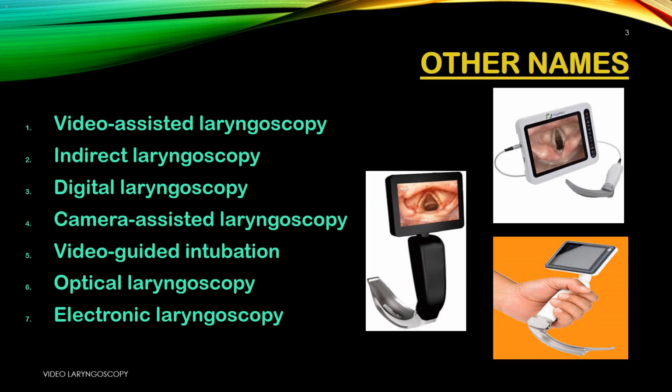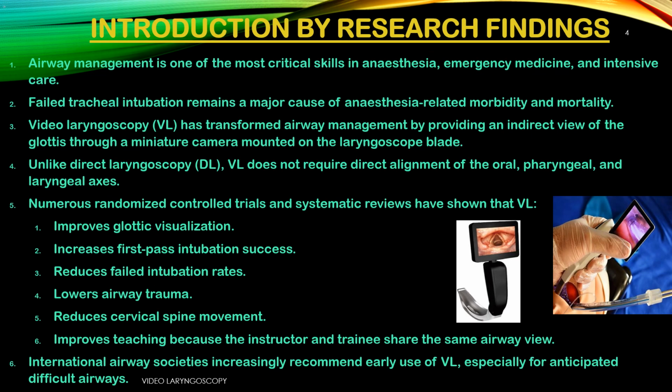Other names for video laryngoscopy. 1. Video-assisted laryngoscopy. 2. Indirect laryngoscopy. 3. Digital laryngoscopy. 4. Camera-assisted laryngoscopy. 5. Video-guided intubation. 6. Optical laryngoscopy. 7. Electronic laryngoscopy. Introduction by research findings.